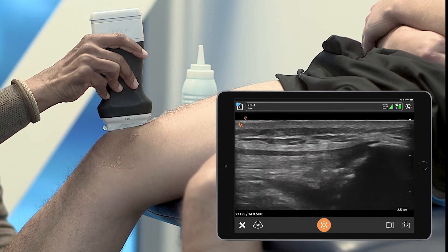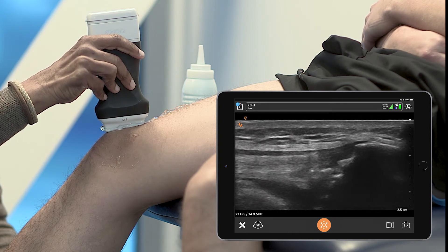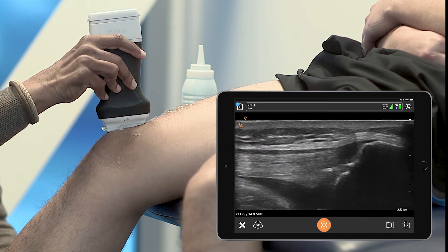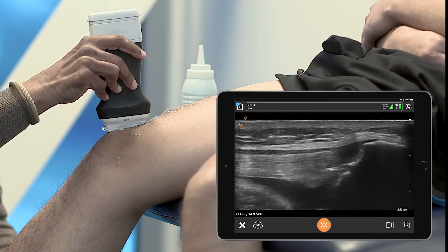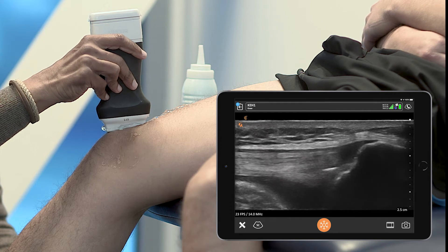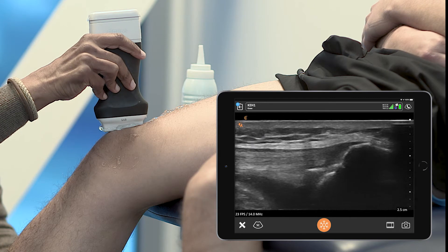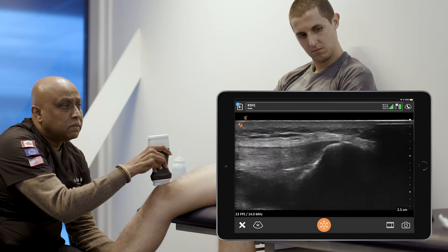We've found the patella, the apex, and we can see the quadriceps tendon glide very nicely over. After 30 minutes, what I can fully appreciate, especially in Daniel's knee, given his duration in the sport over several years, there is no massive pathological event occurring after the load — which is good for Daniel to know.